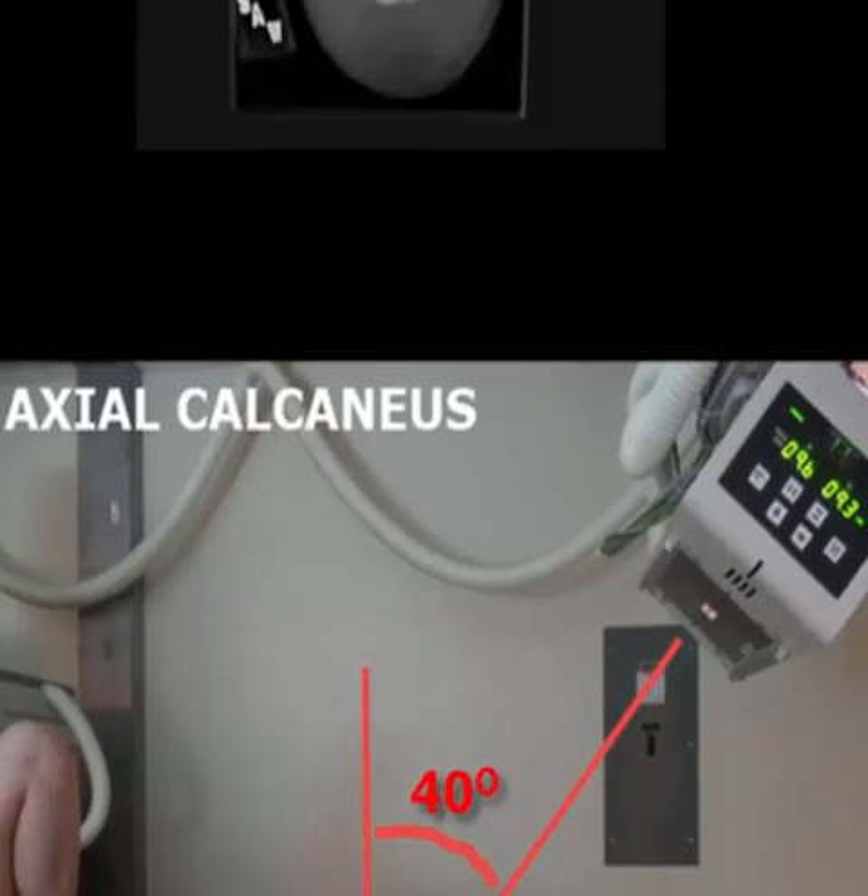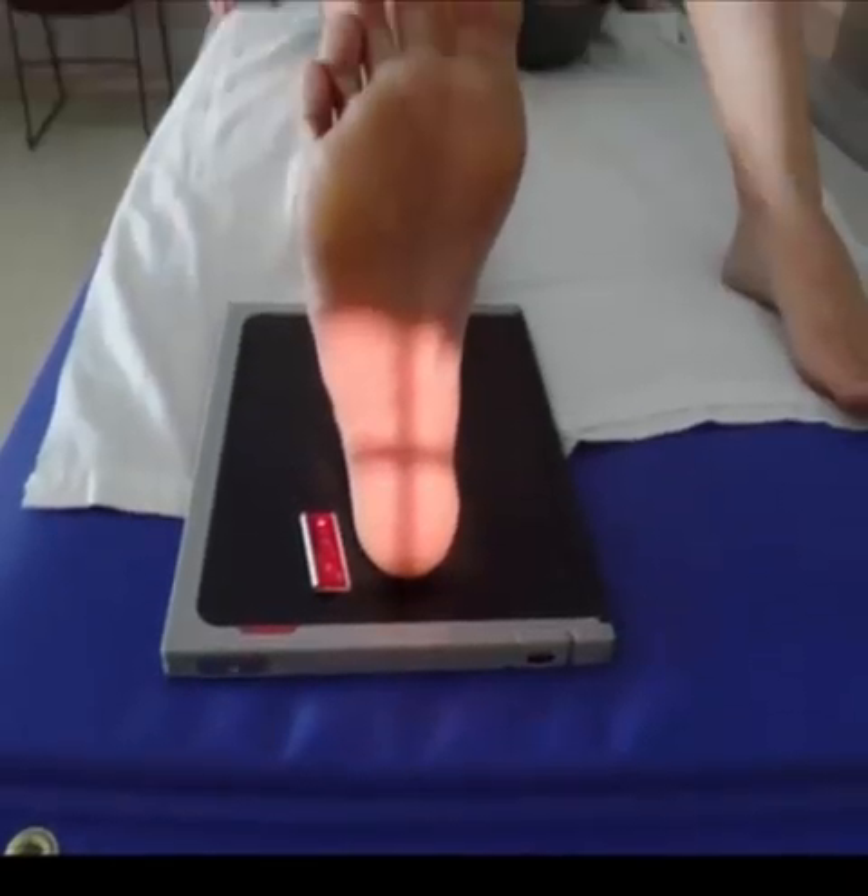Adjust your collimation tightly, as seen here. Also, double-check to ensure the patient's foot is not externally rotated and is properly dorsiflexed before making your exposure.